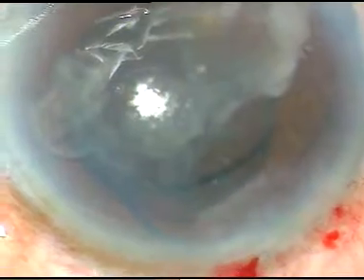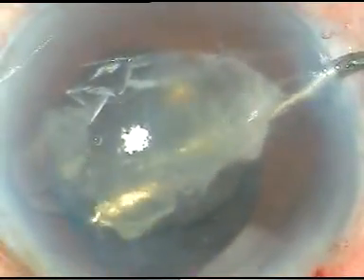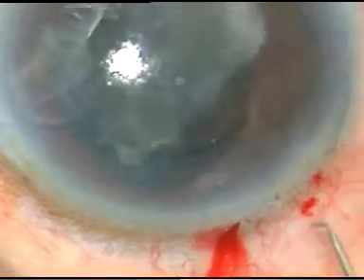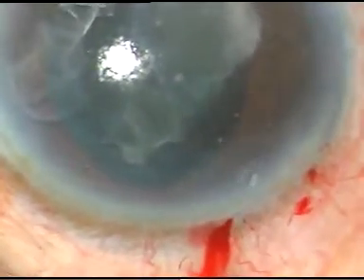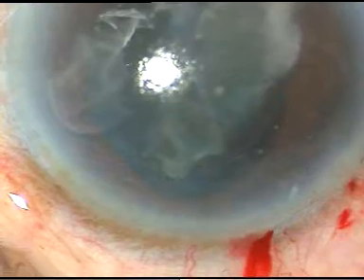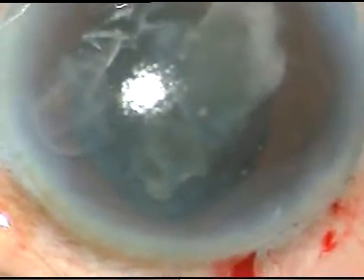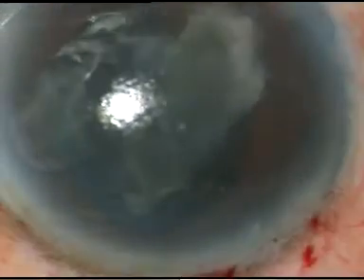So I make the area clear, all the epinuclear material that was there. I remove it, I push it towards 6 o'clock and make this free, and now the lens is in the sulcus.